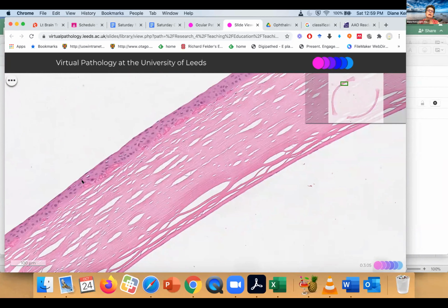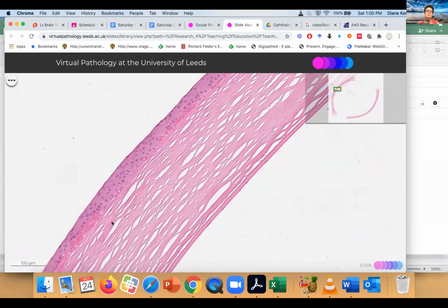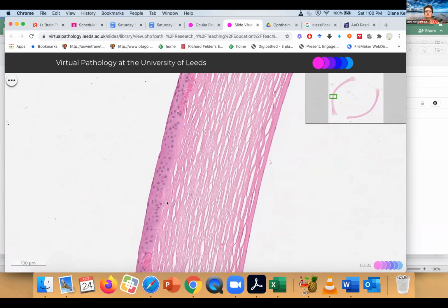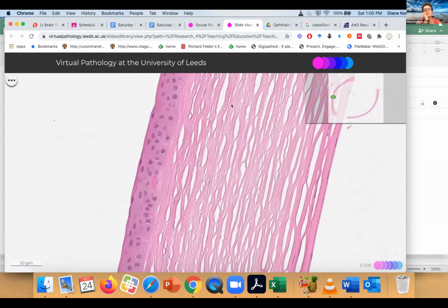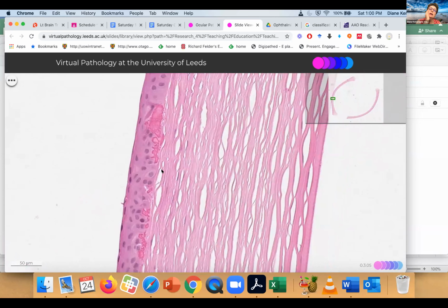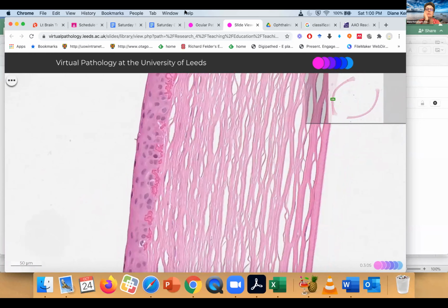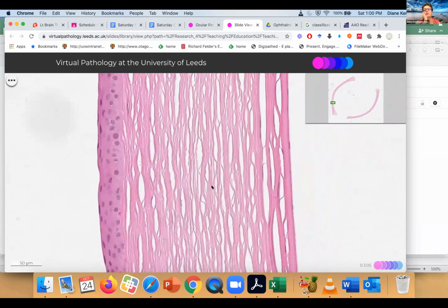The epithelium's normal, and there are deposits here superficially in the cornea along the basement membrane through here. So the deposits aren't continuous, they are quite separate to one another. And we notice that Bowman's is gone, which either means previous ulceration or it's part of the problem. And some of the deposits do actually seem to be above the basement membrane and heading into the epithelium, though this one could well be below it. There's nothing else, the corneal endothelium looks normal and Descemet's looks normal.